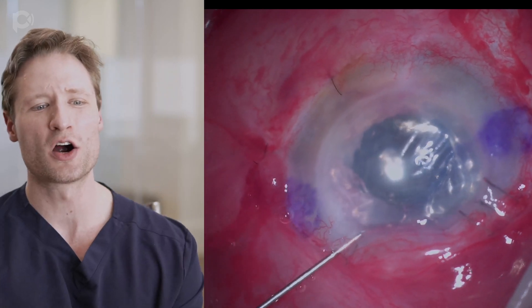That's the conclusion of the operation. In patients who are unicameral like this patient, sometimes we will leave them on the operating room table with a full air fill for 30 minutes to an hour, because once they sit up for the very first time all of the air support will go into the back of the eye. So we usually leave them supine right after surgery for 30 minutes to an hour, and then no posturing at home.